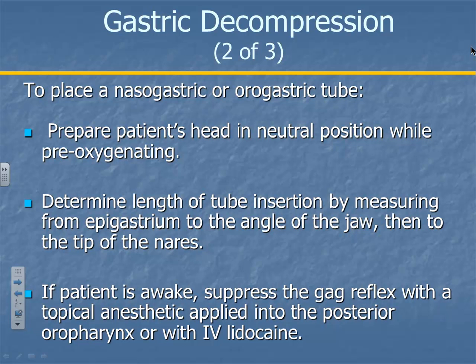So the way we do that is you want your patient to sit forward and lean forward. You hope they're compliant. And you're going to lubricate that tube and gently, you might curl it too, it's going to make it a little bit easier. You're going to feed that down the nose. And you want to make sure you tell your patient, you have to swallow. When they're swallowing, what's going to happen? The epiglottis is going to close over the trachea. So that will eliminate the risk that you're going to put that in the trachea.